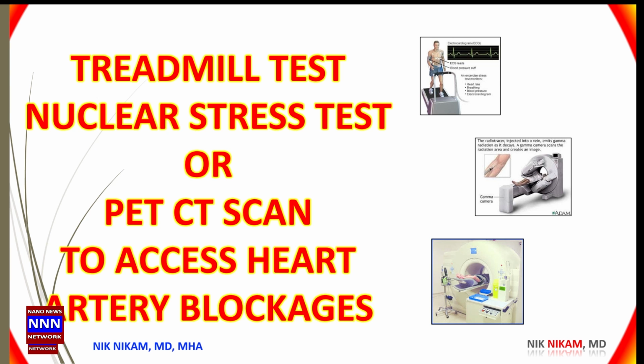That's the simplest test. You can set up a test. You need to be fasting for 4 hours before you do the stress test. No other preparation is needed. You are connected with all these electrodes and placed on a treadmill, and a graduated exercise program is done in order to determine if there are any changes in your blood pressure, heart rate, heart EKG changes, and any extra heartbeats. Based on that, we'll see if you have any significant coronary artery disease.